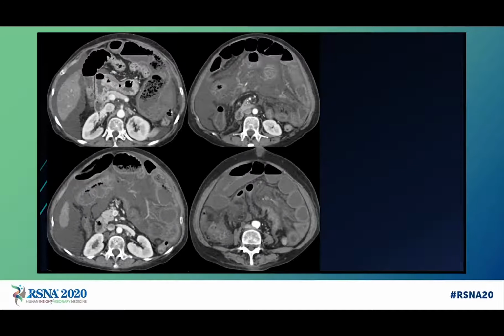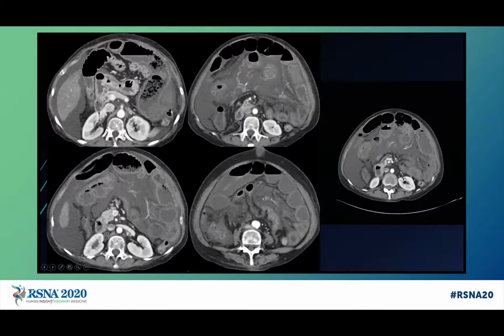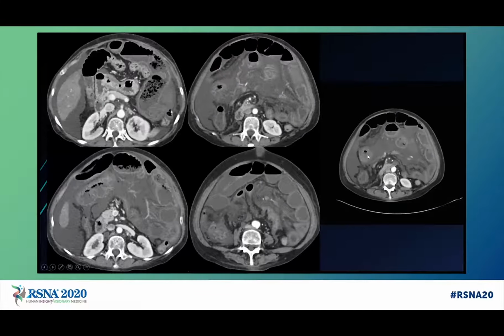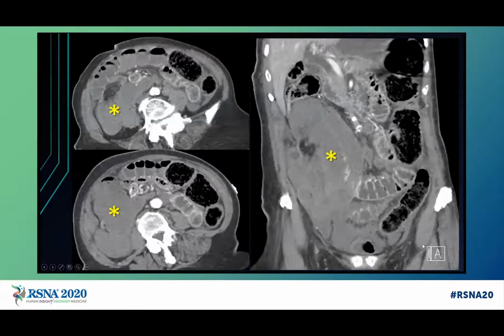Here's a patient for whom I would hope most of us would be concerned about ischemia complicating small bowel obstruction. Notice the dilated small bowel is markedly thickened, especially in the right upper quadrant and central abdomen. There's marked mesenteric edema, there's ascites, and the configuration of this bowel should also make us worried. Look at the mesenteric vessels as we scroll through this case. There's occlusion of the SMV, and the SMA gets markedly narrowed here at the site of twisting. And notice also the bowel passing behind the mesentery here in a patient with an internal hernia, complicating their postoperative anatomy of having a prior gastric bypass.